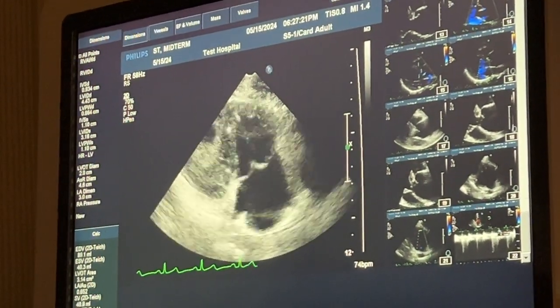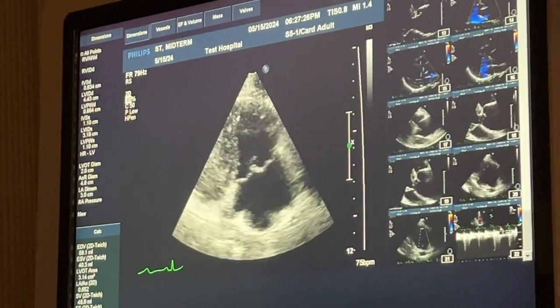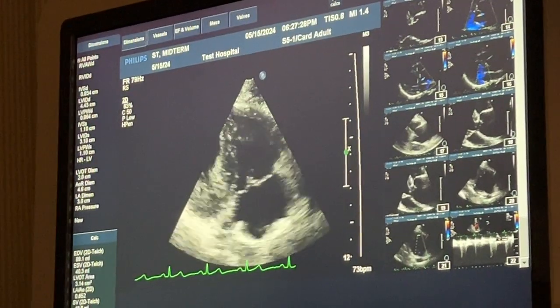Oh, that's even prettier. Nice. What happened? I know. Wow. Really pretty. I'll take it again.